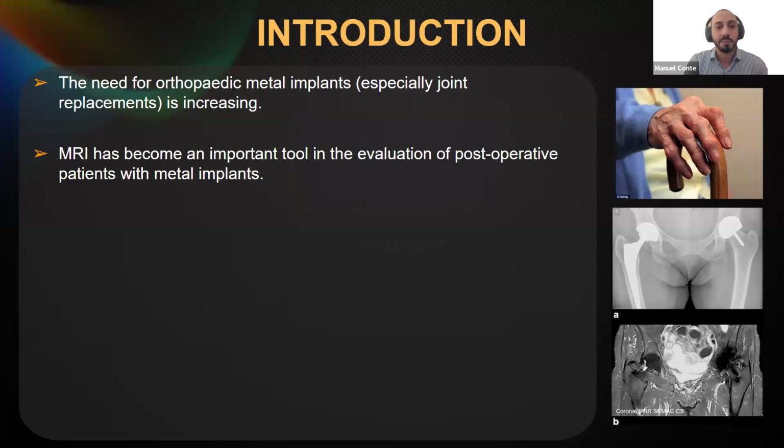And MRI has become an important tool in the evaluation of postoperative patients with metal implants. Many patients complain about pain around the metal implants, and MRI is essential to evaluate infections, inflammation, abscesses, and new formations around the metal implant.